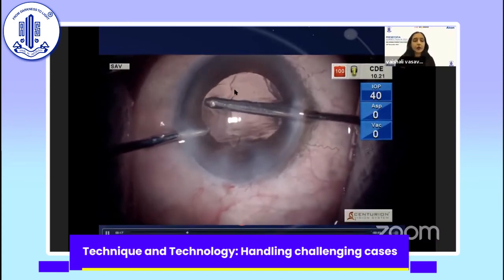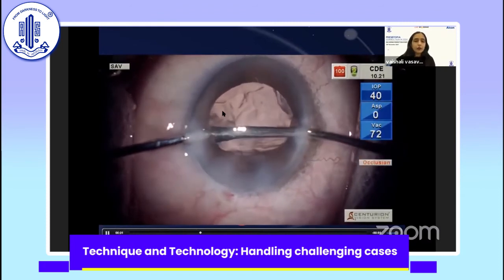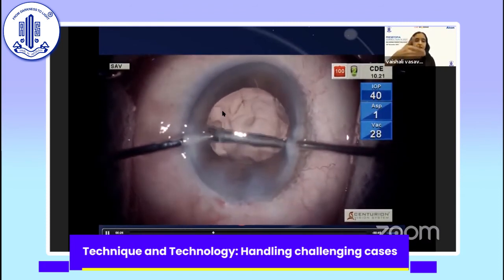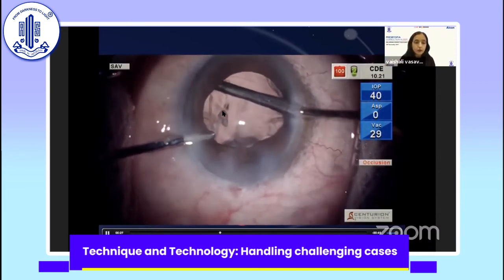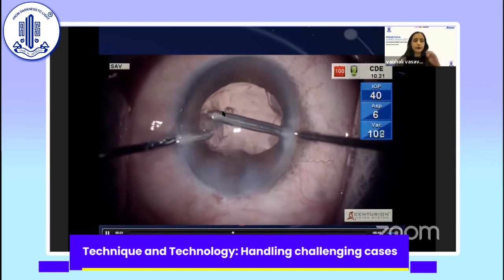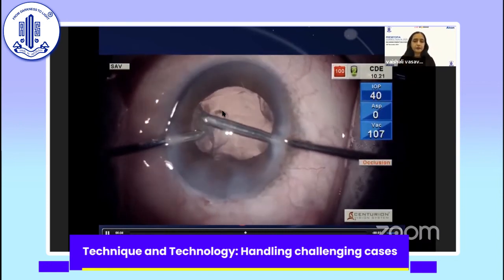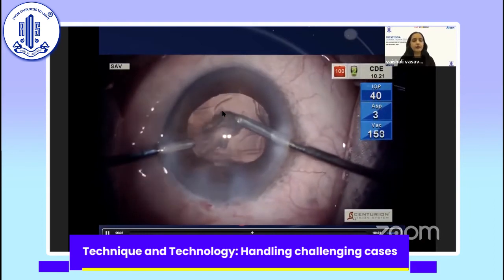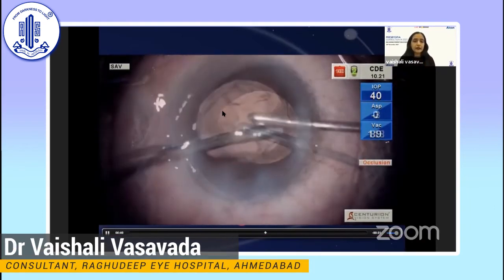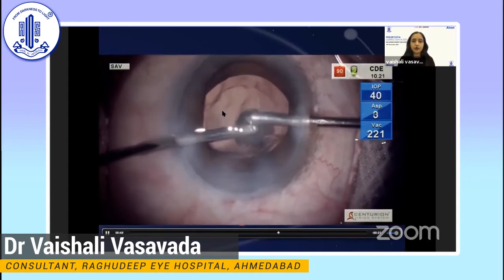Also, because you will have a lot of this heavy viscoelastic here, there might be an issue with clogging. So go into the area of the cortex and then actually engage and swipe it, so that you reduce the zonular stress in this bag, where you really don't know where the end point of the anterior capsule split is. And Dr. Rohit Om Prakash had several years back shown a very good video to detect whether your split has actually gone to the posterior capsule or not.